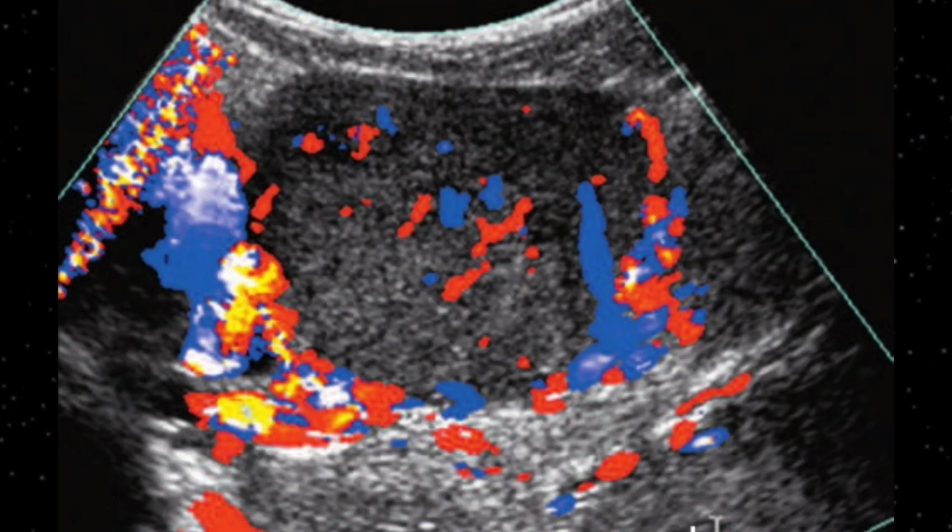In this image, the uterus is lying below that lesion, so it means the uterus is safe. It could not be confused with a fibroid. The second thing is vascularity. This is a highly vascular lesion because of its blood supply, because of its malignant potential. So this is the example of dysgerminoma.